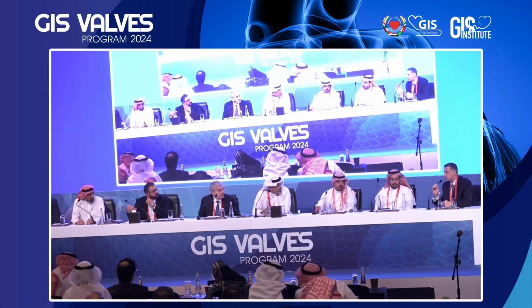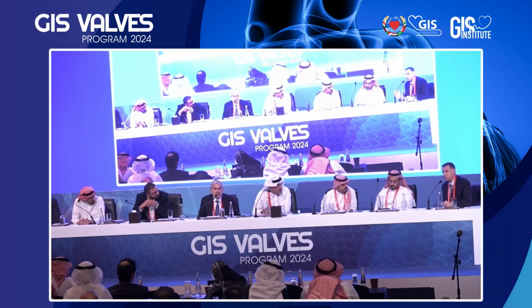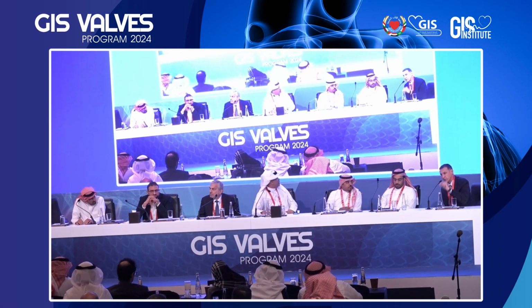Dr. Faraz. Yeah, just a quick comment on that. I know it's very important to fill the ventricle. Thank you for bringing up the LV suicide. But if you face the LV suicide, it's very important how to manage it.